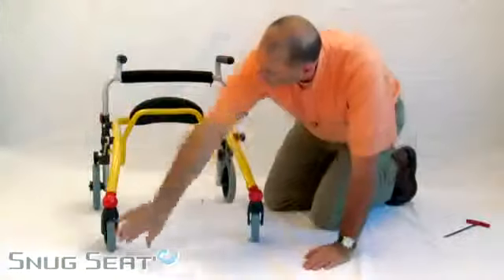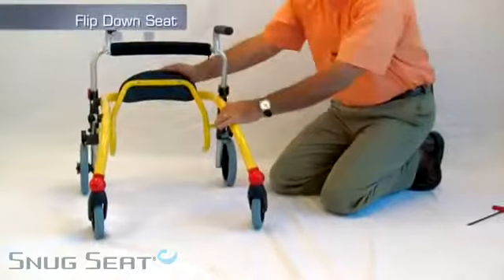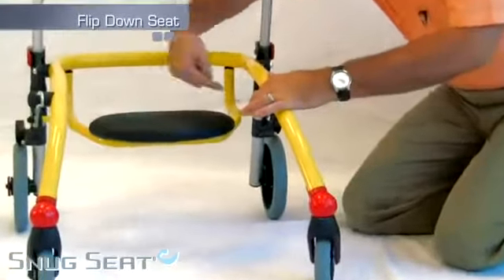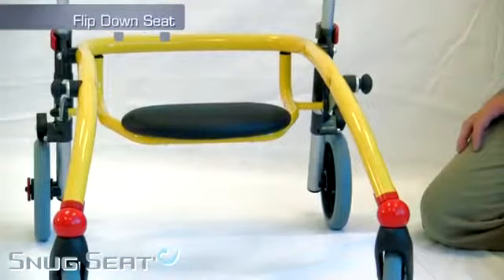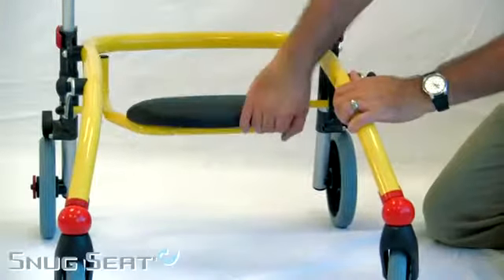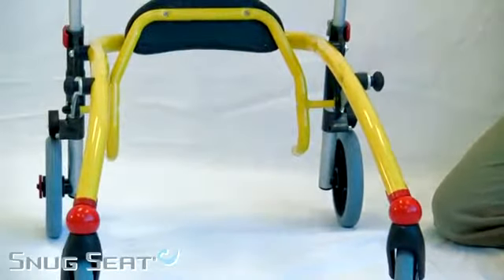The Crocodile also has optional accessories — a flip-down seat that bolts in place and allows a place of rest for a child that is walking. To begin walking again, simply flip it up and out of the way and away you go.